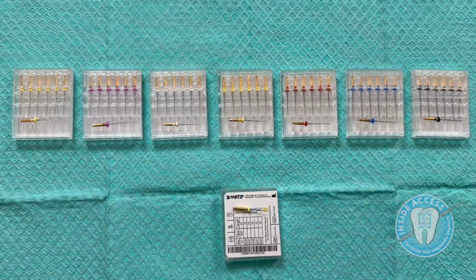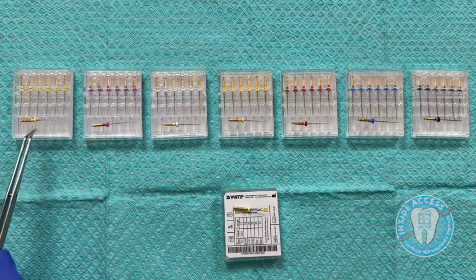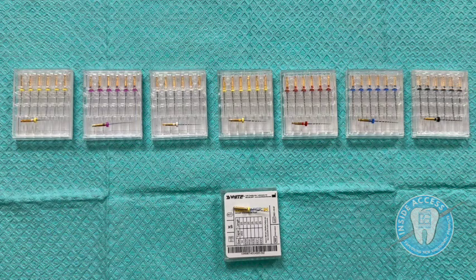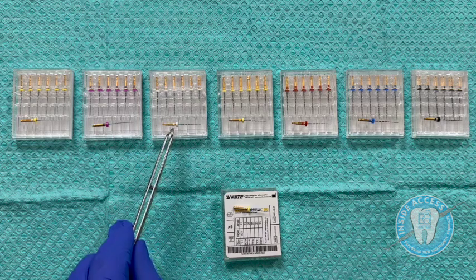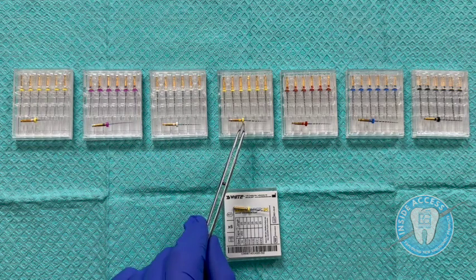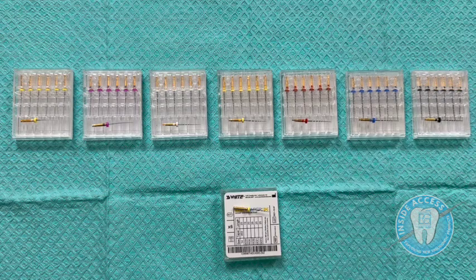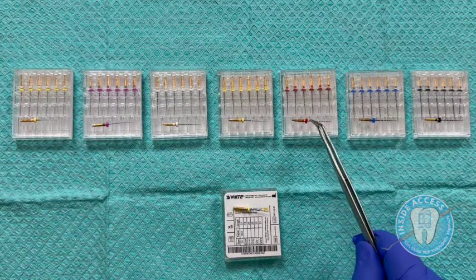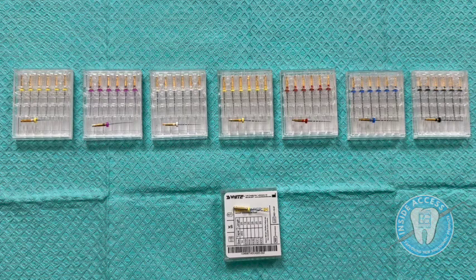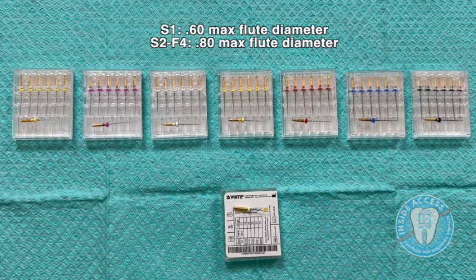Next you have your glide path file at 14/03 taper, then your S1 at 17/03 taper, then your S2 at 18/04 taper, then your F1 at 20/06 taper, your F2 at 25/06 taper, your F3 at 30/06 taper, and your F4 at 40/06 taper — all with a maximum flute diameter of less than 0.80.